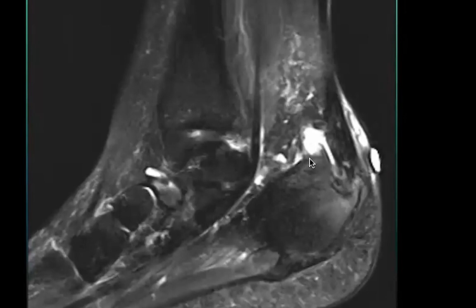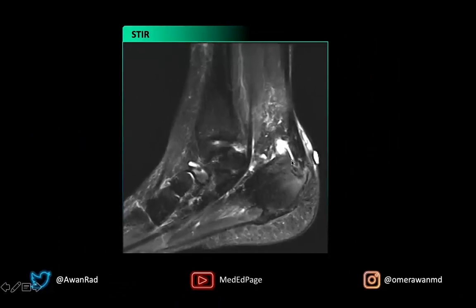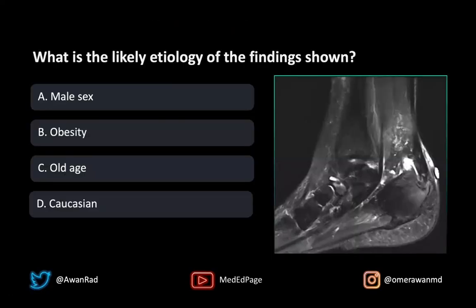And finally, we have a prominent posterior superior process of the calcaneus. Notice this spike here of the posterior superior process of the calcaneus. This is suggestive of a Haglund deformity. And the triad of these findings — Achilles tendinopathy, retrocalcaneal bursitis, and a Haglund deformity — is also suggestive of Haglund syndrome.